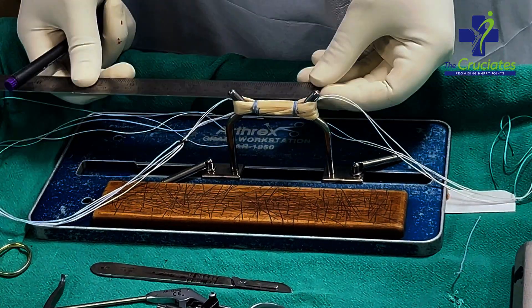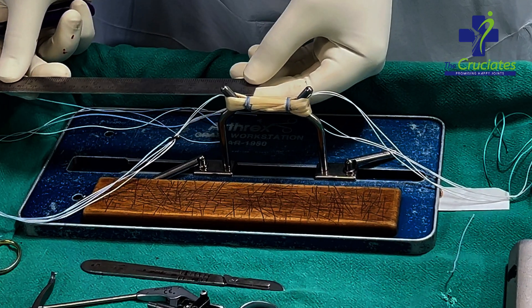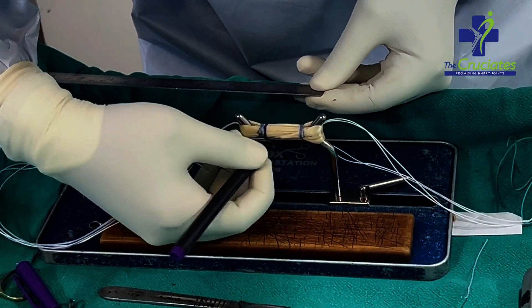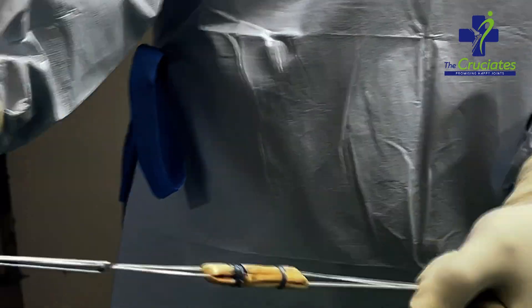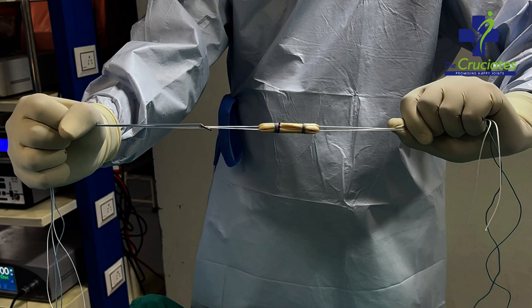Then the same procedure is done on the opposite end as well. Graft length is measured — it should be at least 6 cm. Then marking is done at 2 cm distance from the femoral end of the graft. Now you can see a fully prepared good quality graft. You can also add a fiber tape with this for an internal bracing technique.